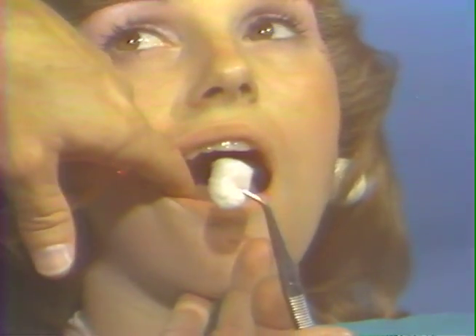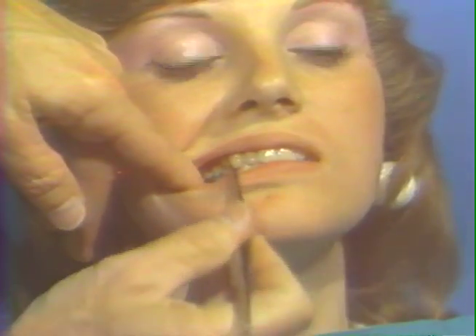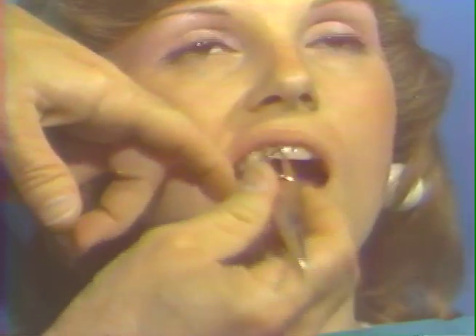For topical analgesia of the mental branches, right and left, now open your mouth. Let me pull your cheek. Don't let me turn your head. Place the cotton roll in the area of the bicuspid teeth in the mucobuccal fold and leave in place. Now open. For the left mental branch, now open. Let me pull your cheek. Don't let me turn your head. Okay. Now open once again.